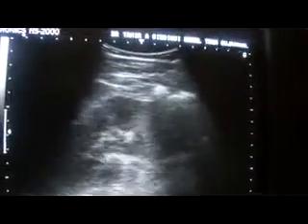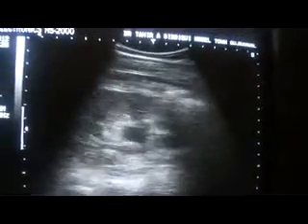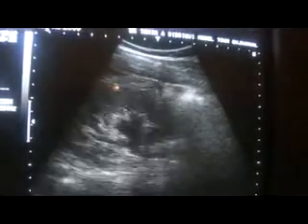Again, you will see these cystic areas are pyramids. These are the dilated calyces — minimally dilated calyces. This is the proximal ureter measuring 8.1 millimeters. So the proximal ureter in this case is dilated.